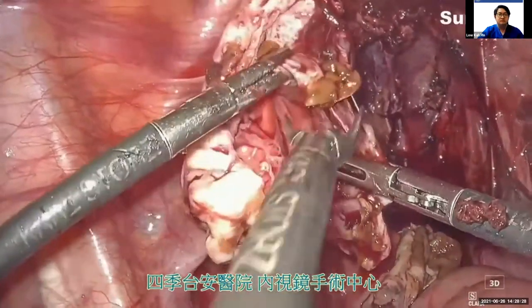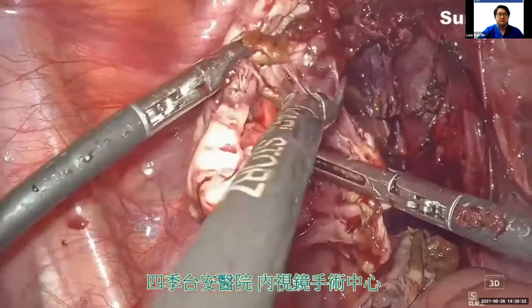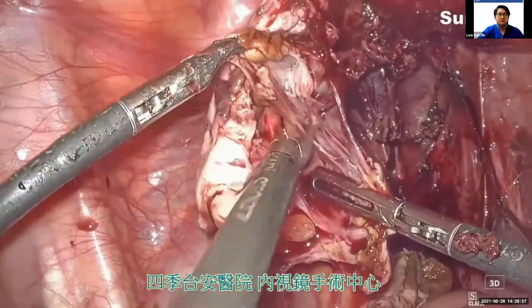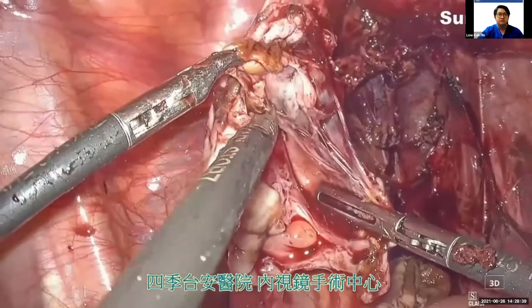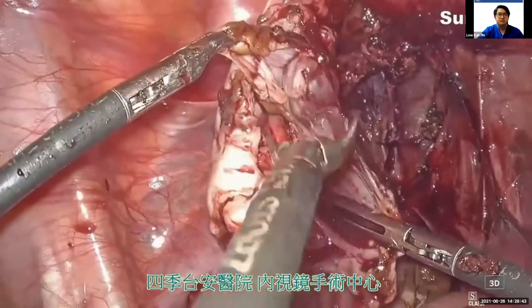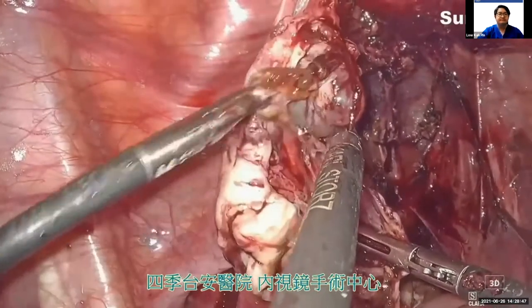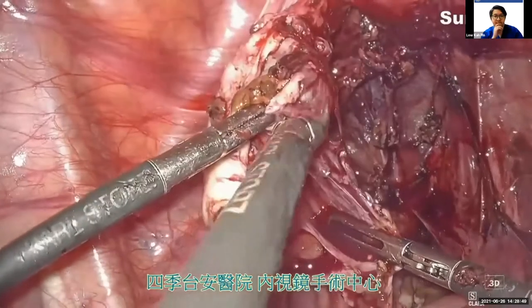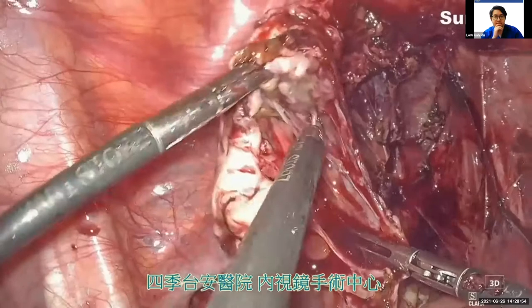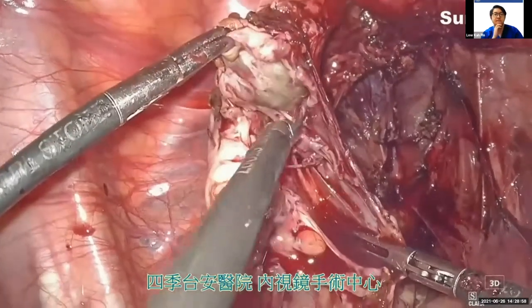Now, stripping of the other half of the cyst wall. You can see I'm performing the stripping, or the cystectomy, or enucleation, very, very slowly and carefully, and try to stay as close as possible to the cyst wall. We have a follicle here. Reserve the follicle to the normal ovarian tissue, and we have another endometrioma here.